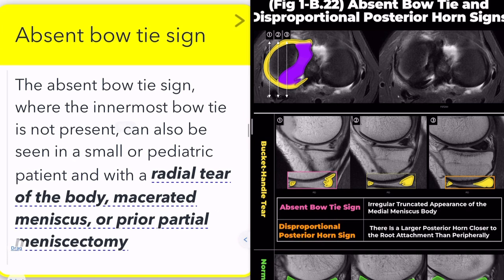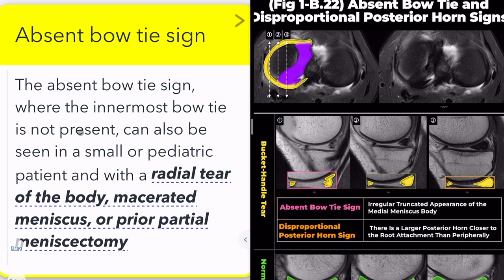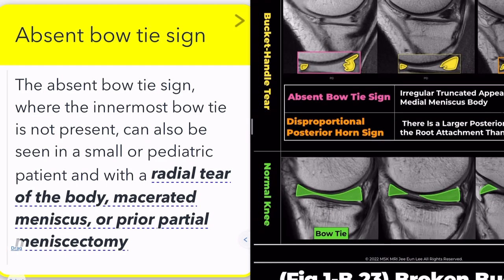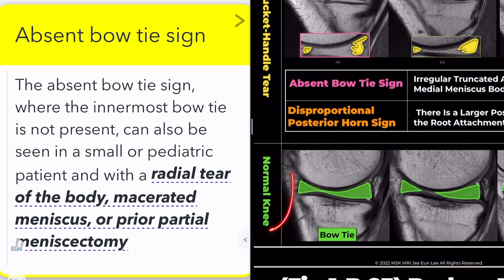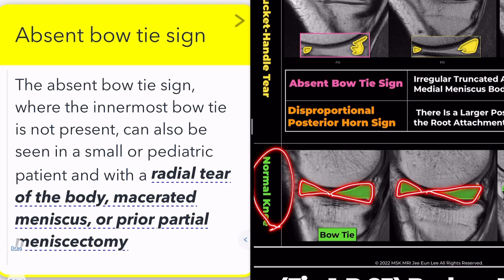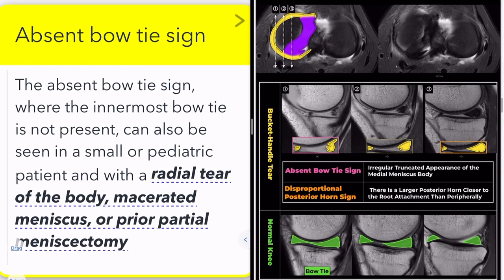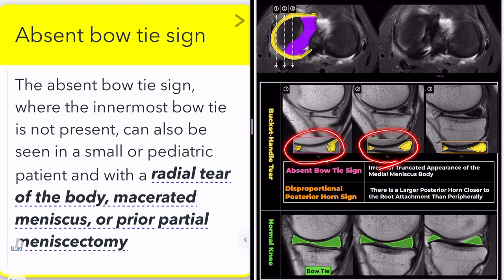First, let's discuss the absent bow-tie sign. This sign is not specific to bucket-handle tears. Typically, the medial and lateral menisci manifest as low-signal triangular structures connected by a thin body resembling a bow-tie. When fewer than two sagittal slices show a normal body of the meniscus, it suggests meniscal pathology.